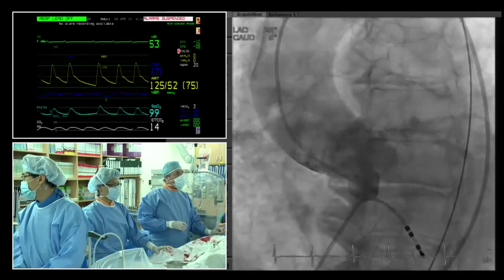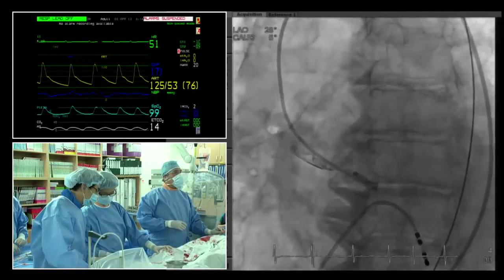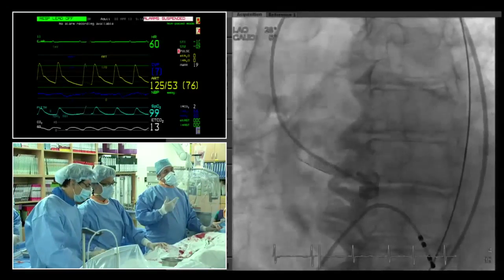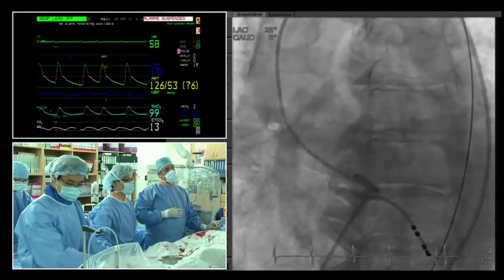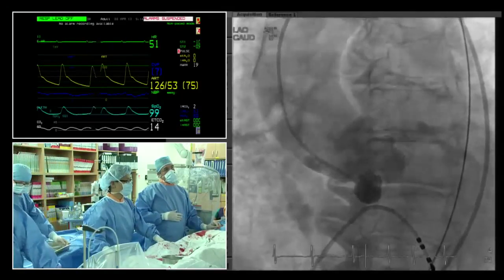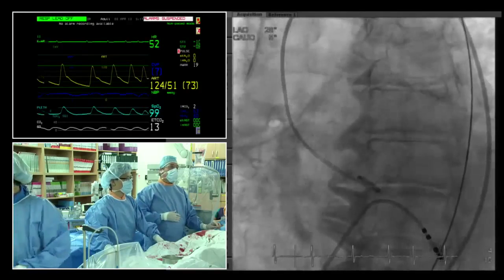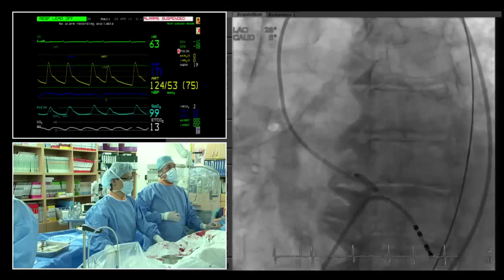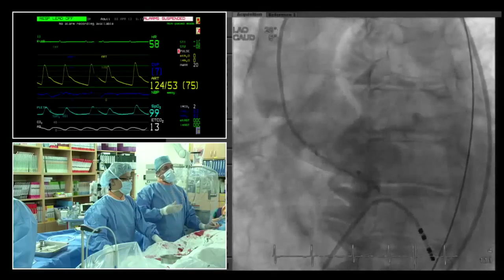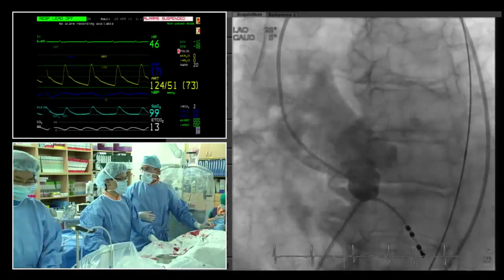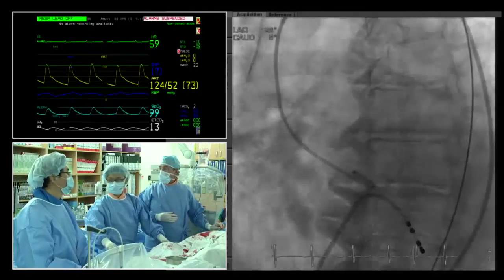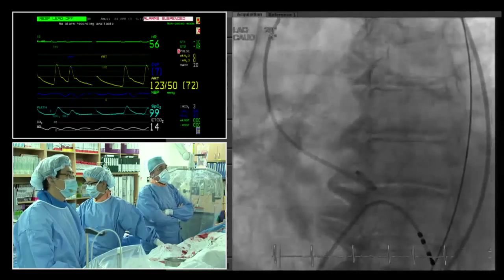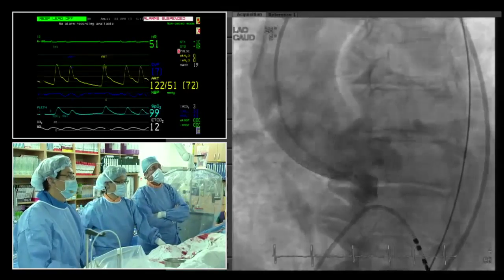The team is comfortable proceeding without predilatation despite the limited coronary risk. While waiting for the valve to load, an important unremarked aspect is mentioned: atrial fibrillation with a bradycardic rhythm and long diastolic periods. The plan is to use pacing to stabilize the heart rate for valve implantation — not at a very high rate, but pacing at 65–70 bpm to avoid long diastolic pauses at the time of implantation.